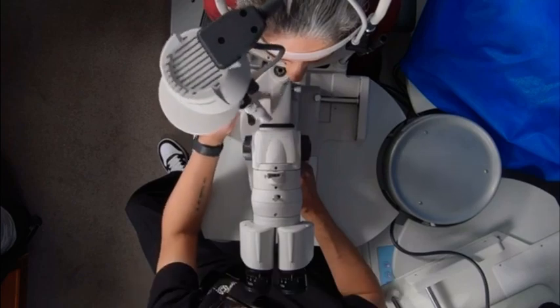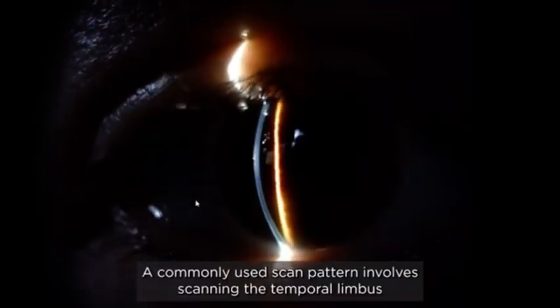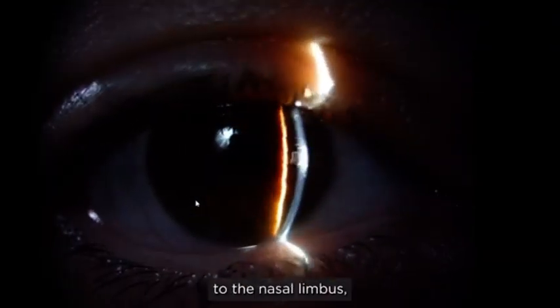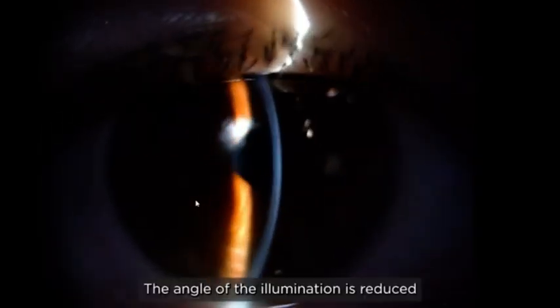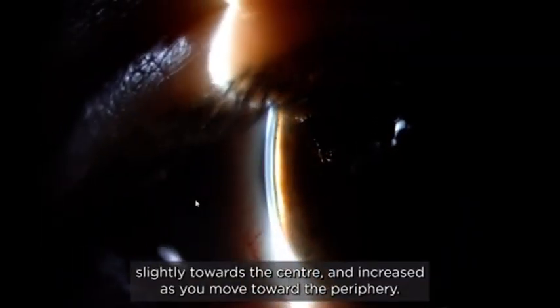A commonly used scan pattern involves scanning the temporal limbus to the center, then continuing from the center to the nasal limbus, switching the direction of the illumination as you cross the midline. The angle of the illumination is reduced slightly towards the center and increased as you move towards the periphery.